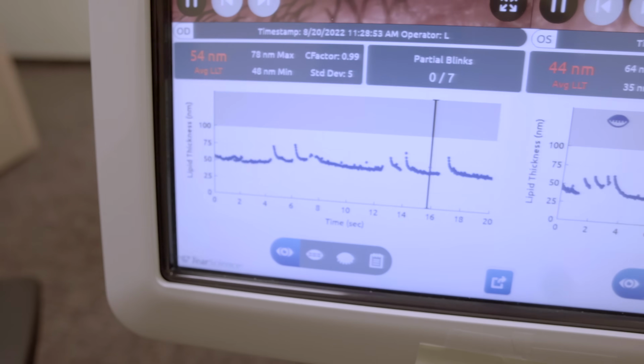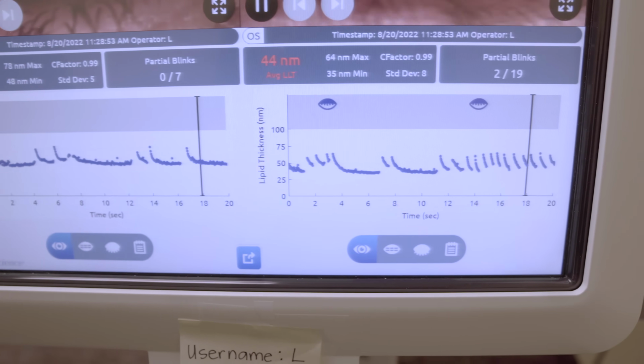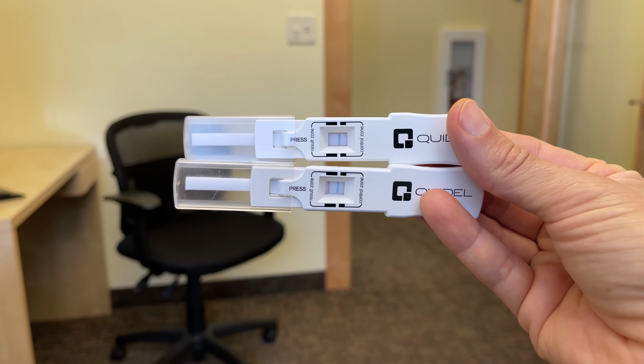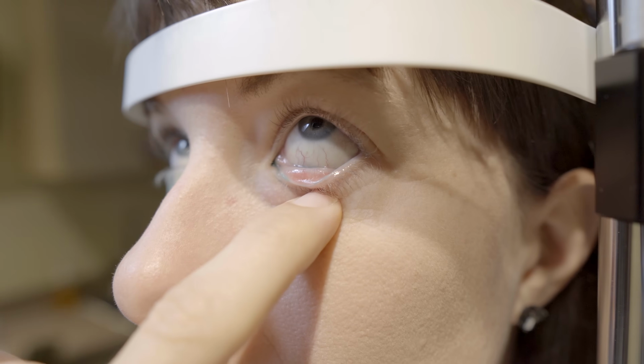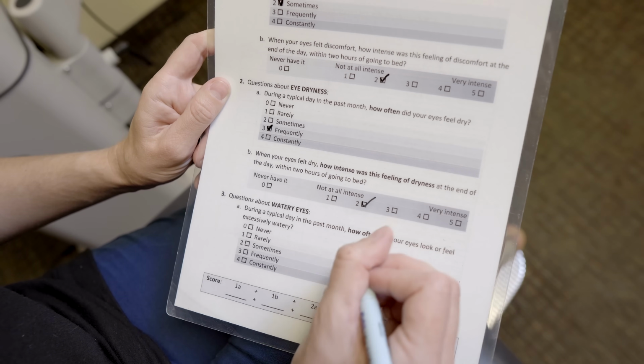Okay, so from all of this, we now know the quantity of tears someone is producing and if that's playing a role, the quantity and quality of the oils that are being produced, and if somebody's glands are present on the eyelid. We know if blinking or exposure is potentially a problem, if inflammation and surface damage is contributing, as well as a medical history and medications, as well as a survey to base our future treatments off of.